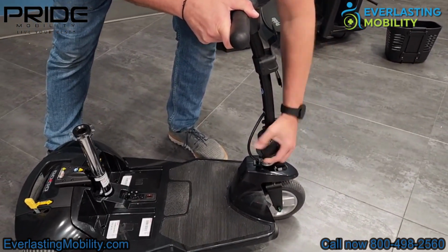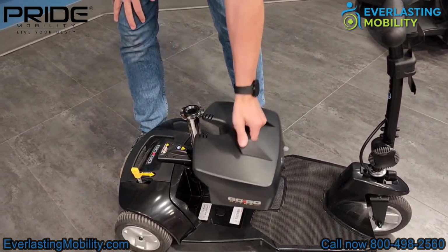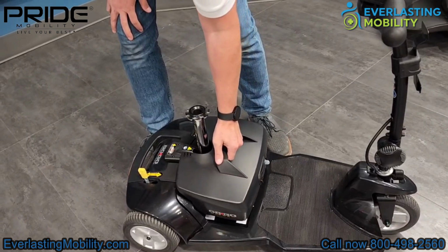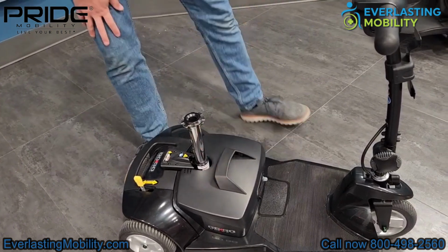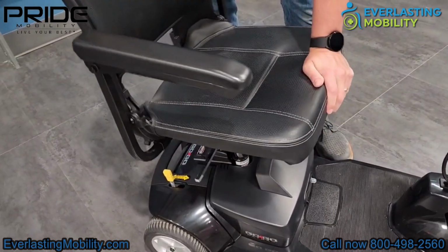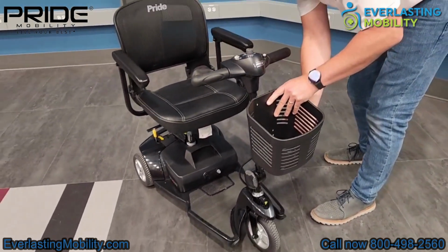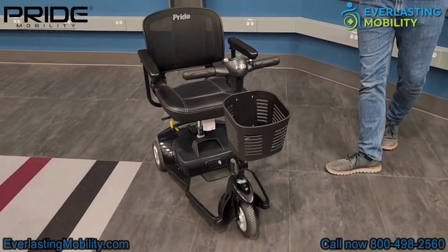After that, you would put the battery pack right back onto the floorboard, and once you set that in place, there's metal connectors that connect to the battery pack, and that way you know that it is secured into place. After that, take the seat, put the peg on the seat, line it up on the seat post, and you just drop that into place. And the last step, just slide the front basket right back onto the tiller, and now you have reassembled the scooter in less than 60 seconds.